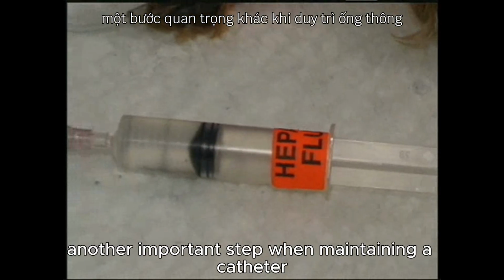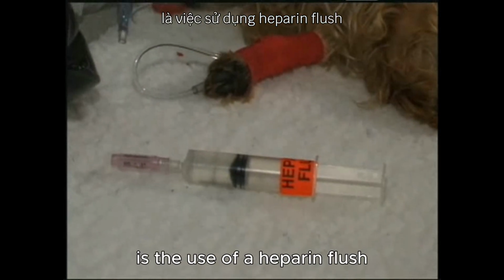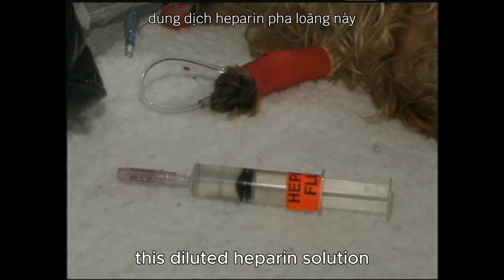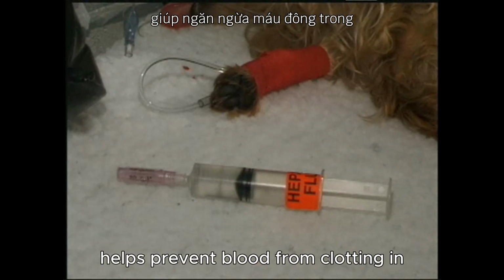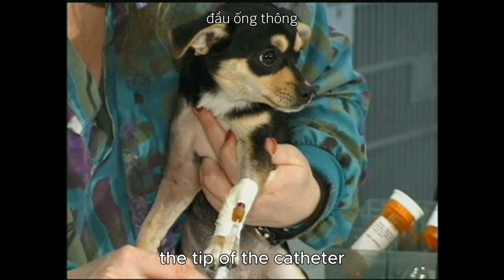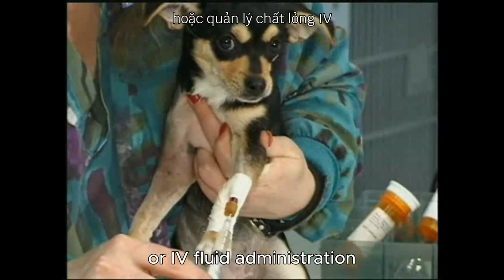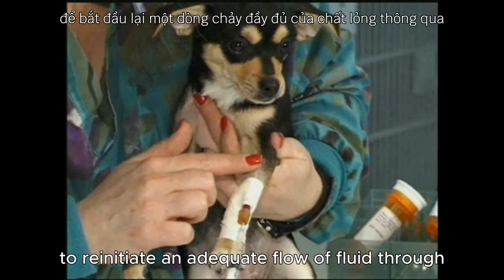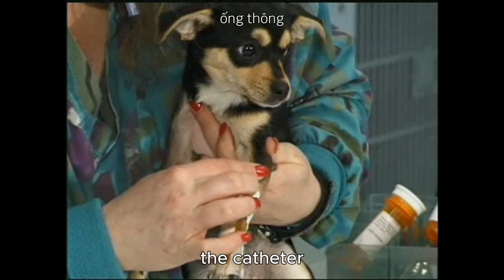Another important step when maintaining a catheter is the use of a heparin flush immediately upon discontinuing the flow of fluids. This diluted heparin solution helps prevent blood from clotting in the tip of the catheter, preserving it for future injections or IV fluid administration. Another flush may be needed to reinitiate an adequate flow of fluid through the catheter.